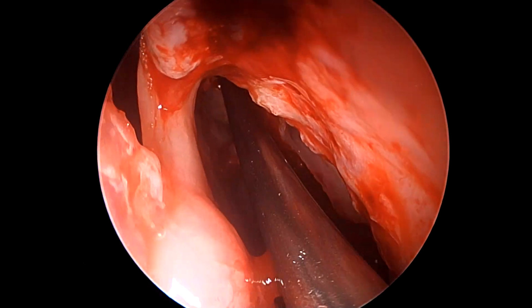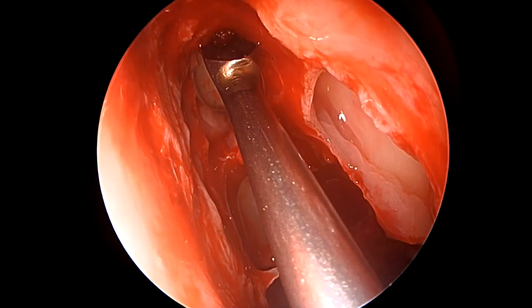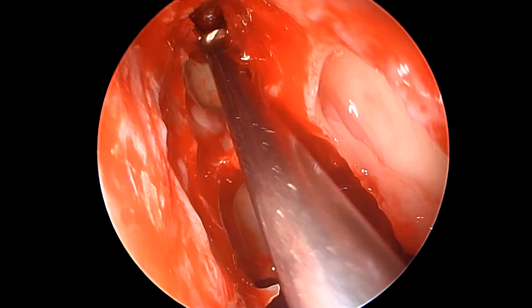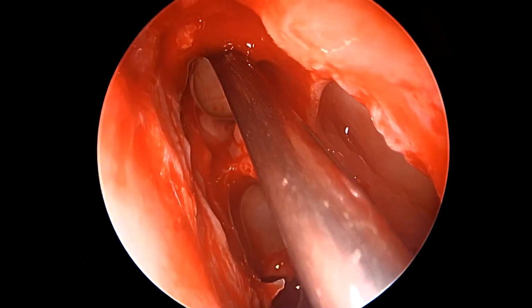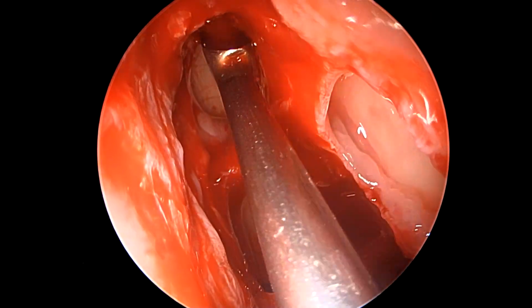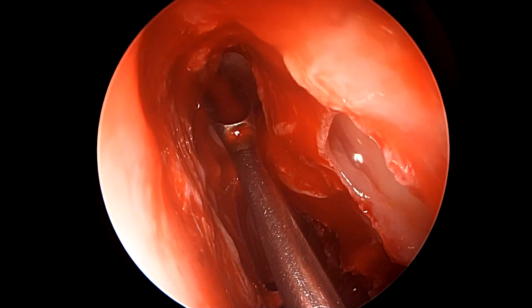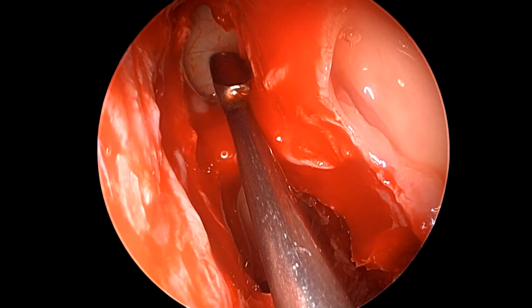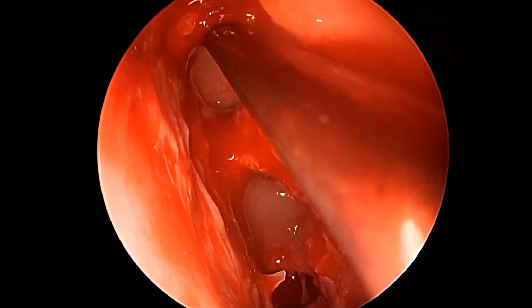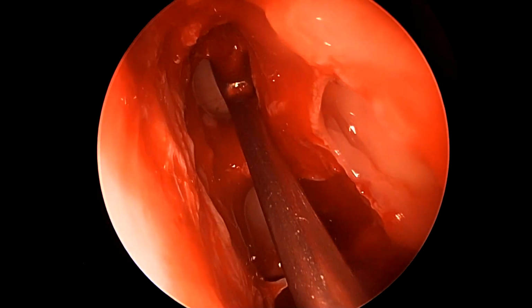And we can still try to slightly increase that even more and remove that slight party wall to do that more. One must not go too high, because if you go too high and you fracture the anterior wall of the suprabullar cell posteriorly, then there is again a slight possibility of creating a breach in the posterior table of the frontal sinus, which would lead to a bad situation, because then that will have to be closed, and that risks having a CSF leak with less than adequate exposure.